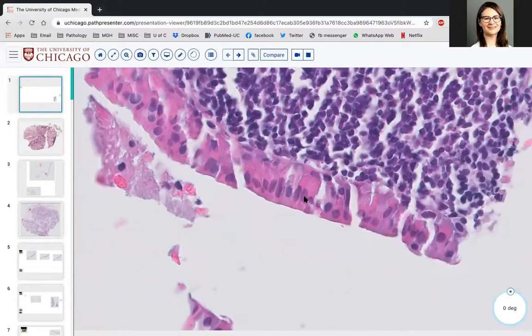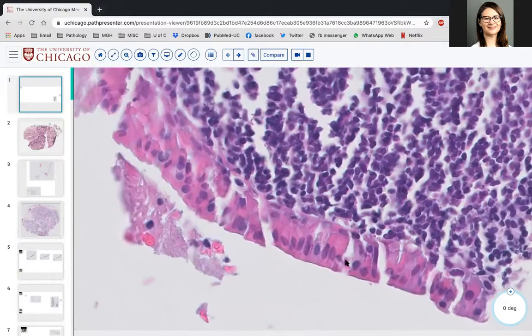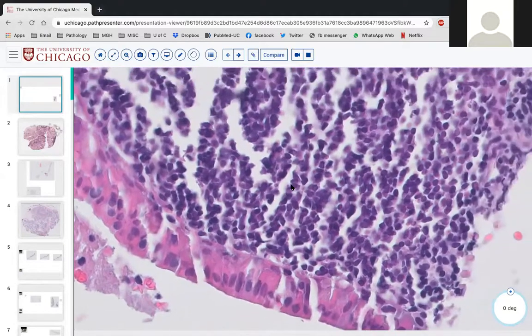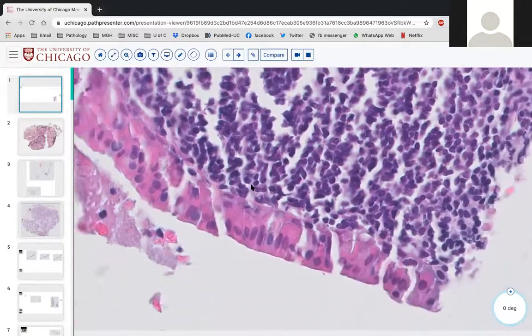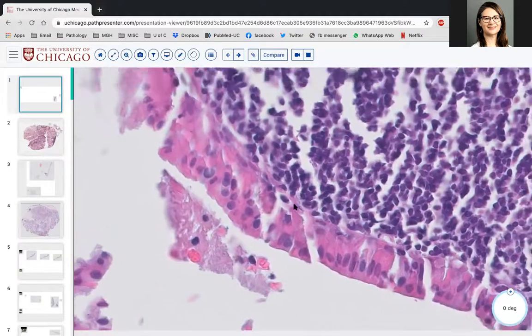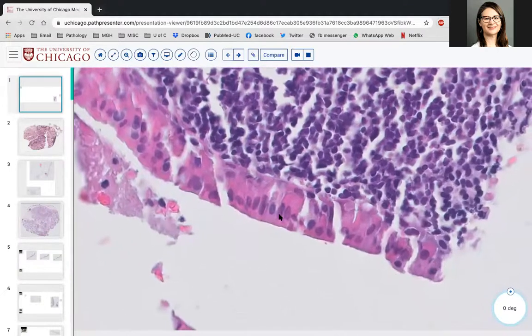Awesome. And this was, oh, I totally forgot the history. A 61-year-old female with bilateral swelling of the parotid for 5 to 6 years. So tell us. So the bilateral parotids for sure are consistent. And then it didn't say in the history, but we'd also suspect that the patient might be a long-time regular smoker.